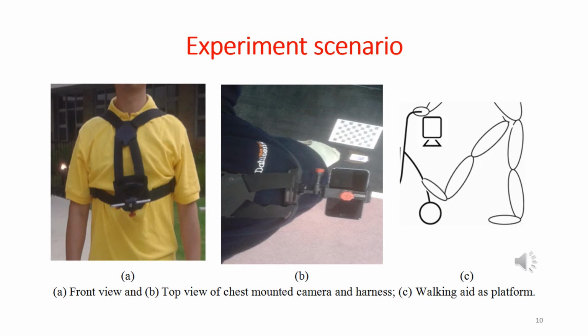The downward-facing camera is mounted on the participant's upper body or torso via a harness shown in the picture. The camera does not have to be perpendicular to the walking plane or any reference. Any people can wear it without calibration or technician support.